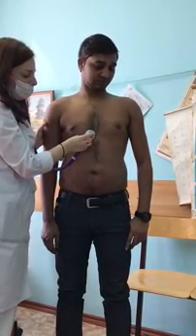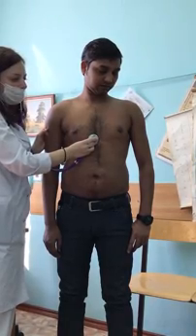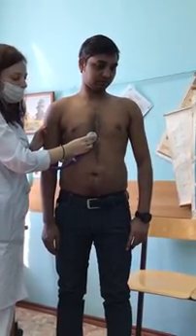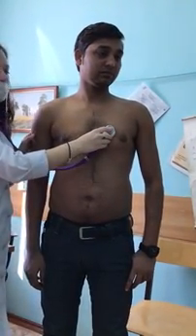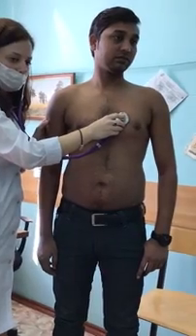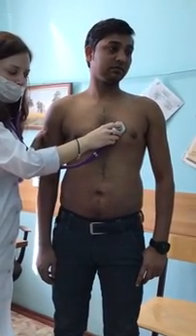At the right side of the xiphoid process, we listen to the tricuspid valve. Then at the third and fourth intercostal space at the left side of the sternum, we listen to the aortic valve at Botkin-Erb's point.